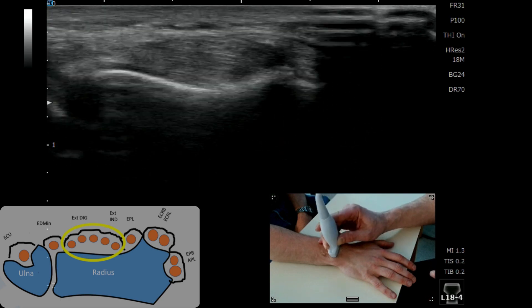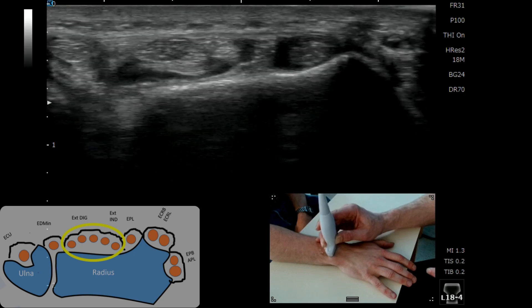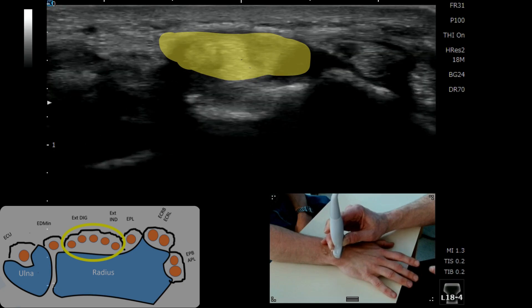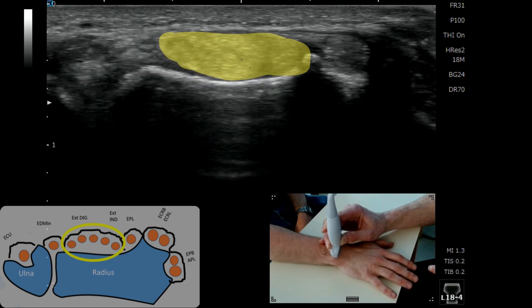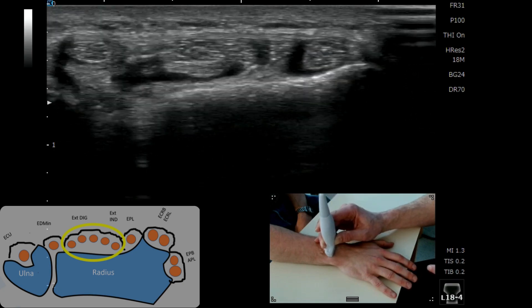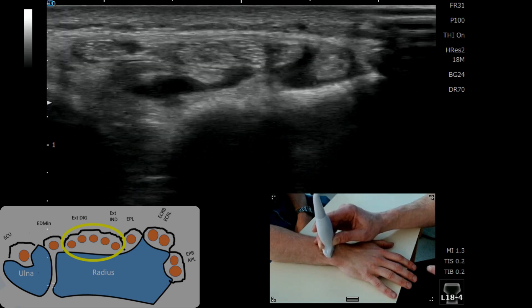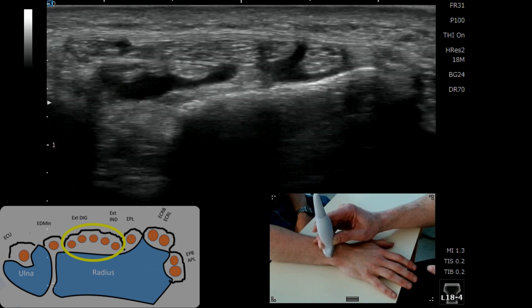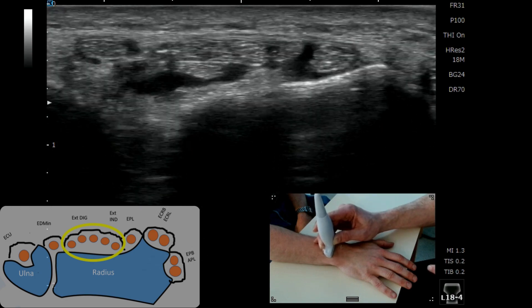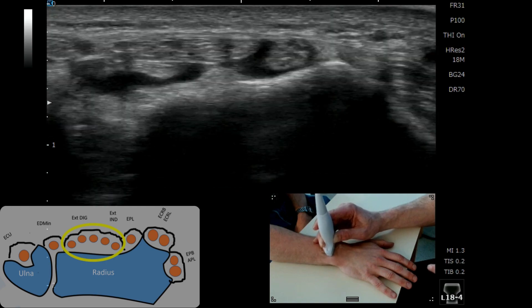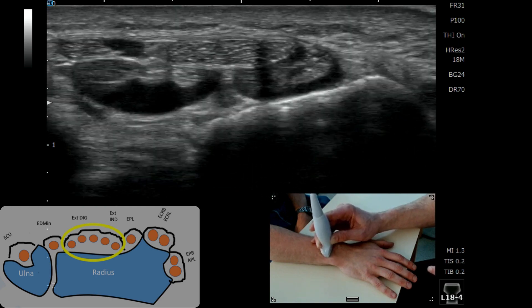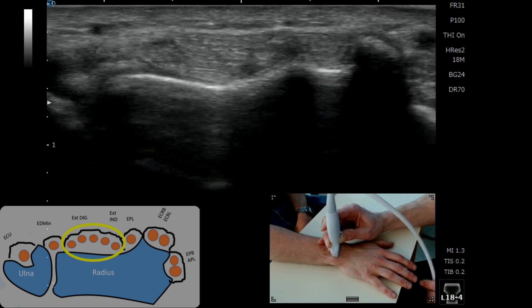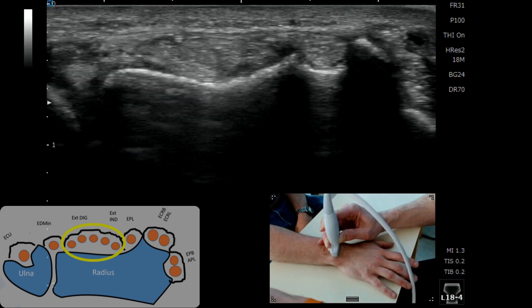The next compartment along is extensor digitorum, sitting in that shallow dip on the distal radius. Just be conscious that you're not calling that black area around the tendons as fluid — that's a classic pitfall of ultrasound. It's the distal musculotendinous junction of digitorum; it's not fluid, you can't squash it, it's not tenosynovitis. Coming down, digitorum is just sitting in that dip.